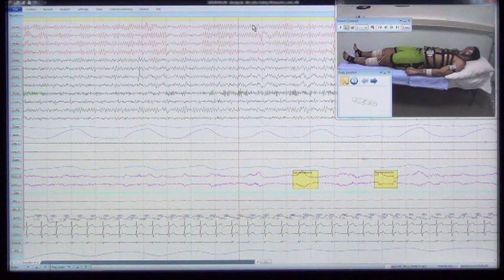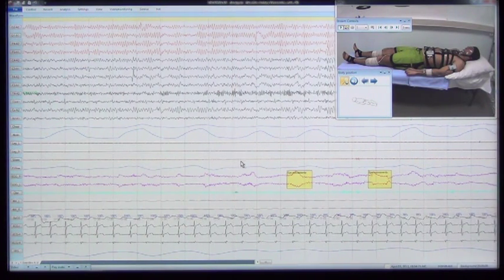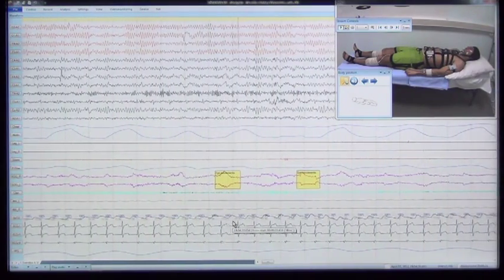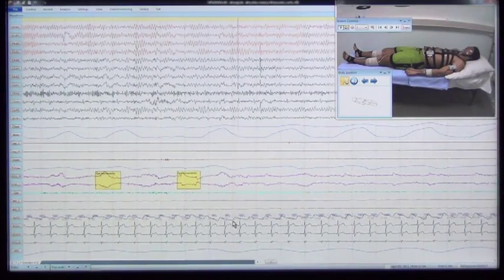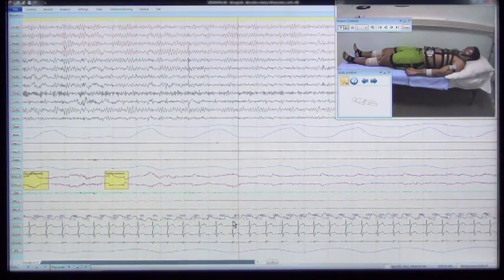Let's look through the test record of PSG study parameters. Signals according to the montage are displayed on the screen. The video monitoring window is opened, and video data are synchronized with the marker of the current time position. The 12 EEG channels allow analyzing the background pattern, intensity of alpha activity, and rhythms of other frequency ranges.